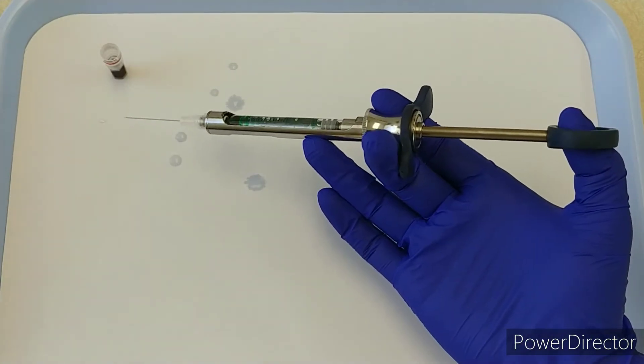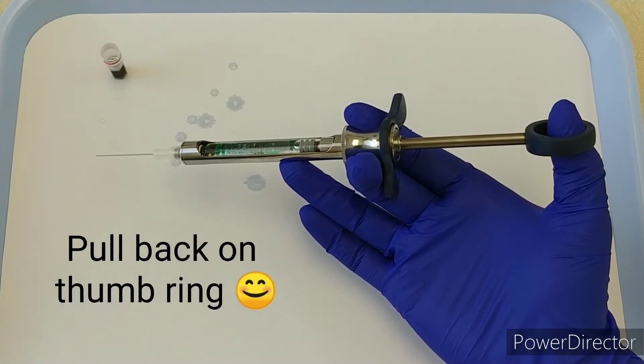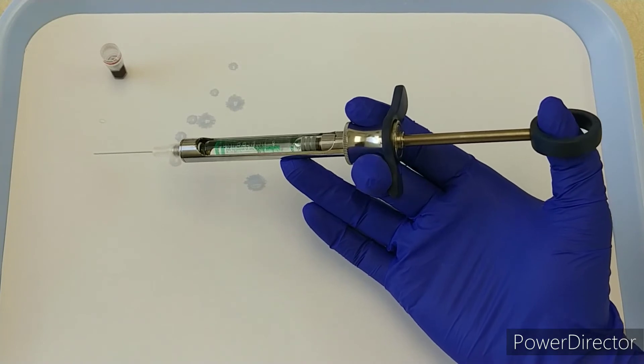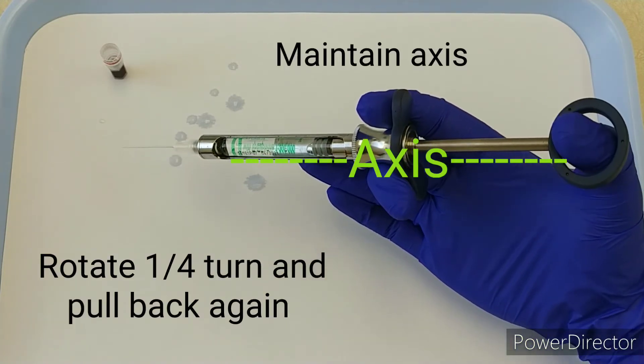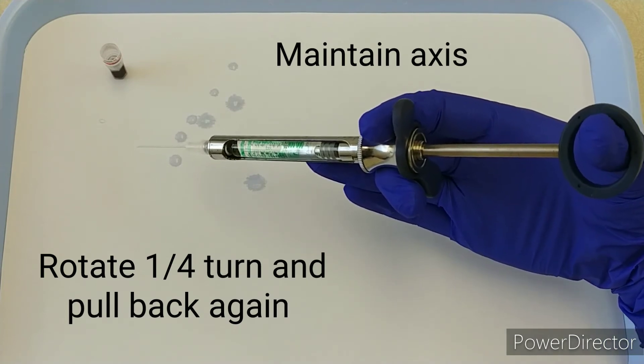My aspirations are going to look a little like this: I'm going to pull back on the thumb ring—I got a little visual of some bubbles there—then I'm going to rotate a quarter turn, another aspiration, more bubbles, and I could see both of those.